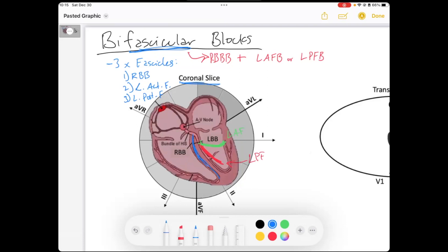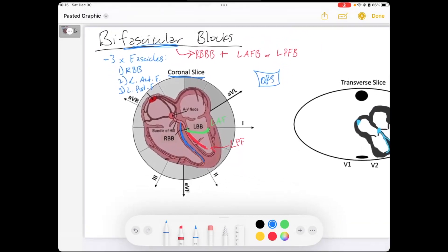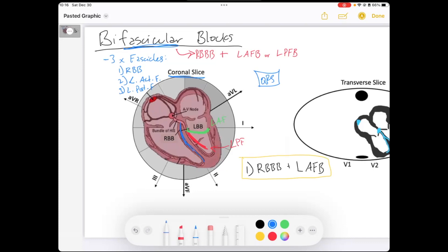This is all QRS-related because it involves ventricular depolarization. The most common type of bifascicular block is a right bundle branch block plus a left anterior fascicular block. That is the most common type because the left anterior fascicle is supplied by the left anterior descending artery, so any ischemic heart disease to that one vessel can cause damage to the left anterior fascicle.